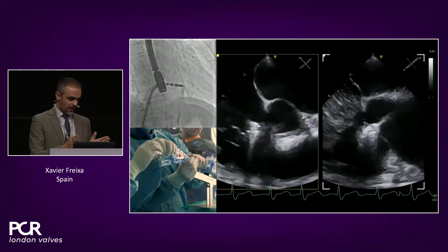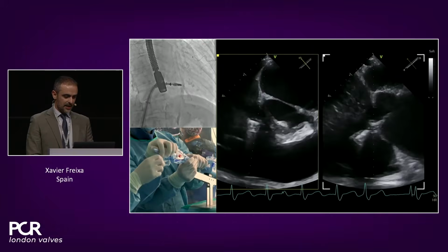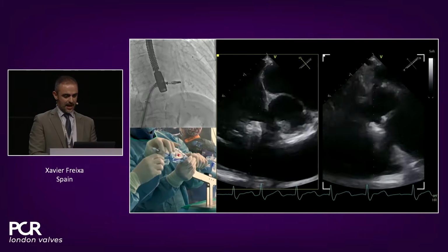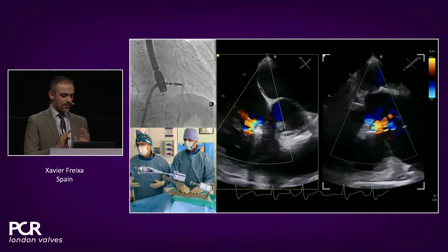So then, we were happy. I mean, we're still following the plan. And now you see that we're releasing the clip. If we got that coaxiality, that perfect axial alignment, you'll see that the release of the clip is completely predictable.